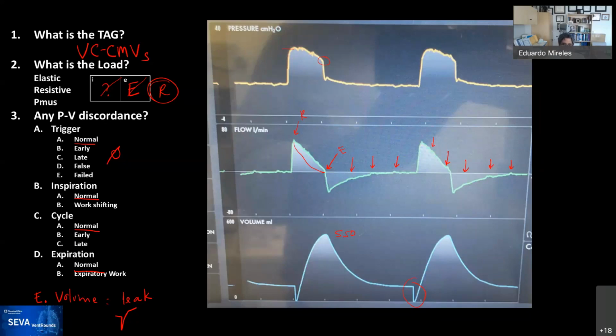Yeah. First of all, you have to understand that even if you're in volume control, the lungs are only seeing pressure control. The lungs are always seeing the pressure drop across the resistance. So if the resistance happens to be at the level of the trachea, because let's say you have a leaky cuff, then the flow through that resistance gives a back pressure, and that's the pressure that the lungs see. It's not the pressure that the ventilator sees. So you're always in pressure control, but if you have it set in volume control, you don't really know what the inspiratory pressure is at the patient. The other thing is with volume control, you have by definition a preset tidal volume.